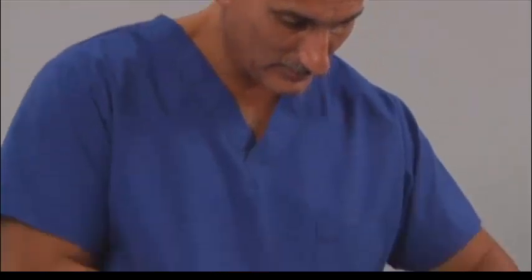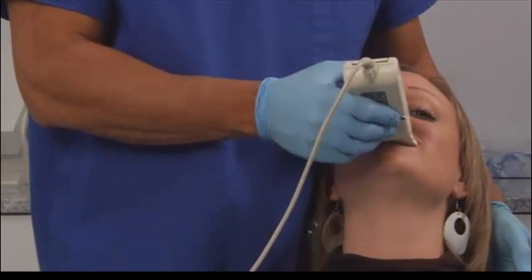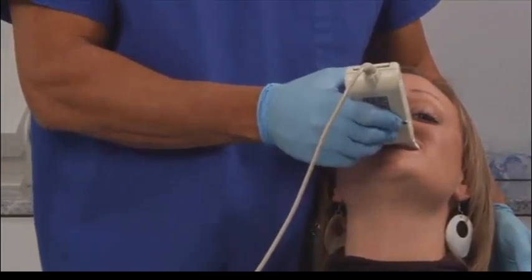Okay, this time you're going to bite down and slide forward again. Okay, bite down once for me. Good. Open. Bite down firmly. And now go straight forward. Keep going. Good.